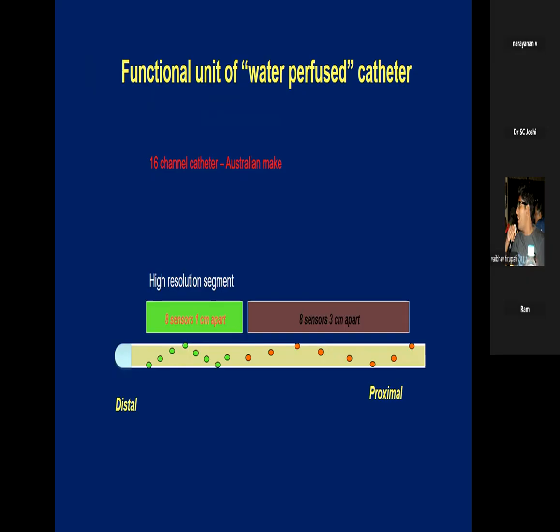3 centimeter apart. That is why this catheter is not ideal to evaluate patients for any upper esophageal sphincter problems like a cricopharyngeal spasm or a bar, all those things. So it is best suited for the mid body, lower esophageal sphincter rather than the upper esophageal region.